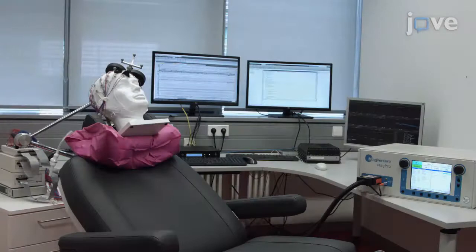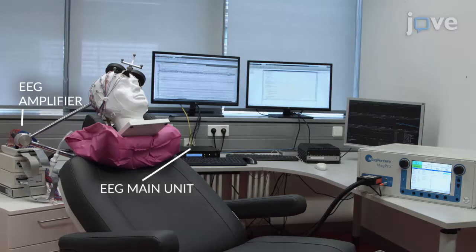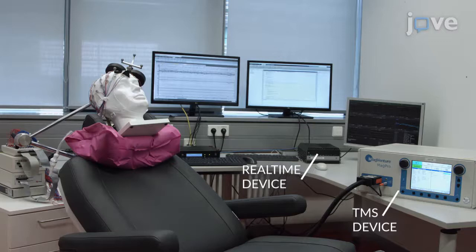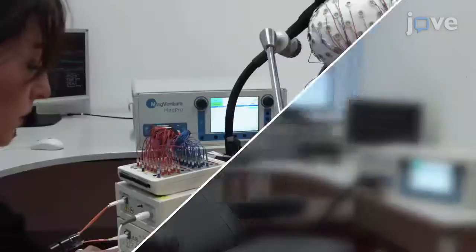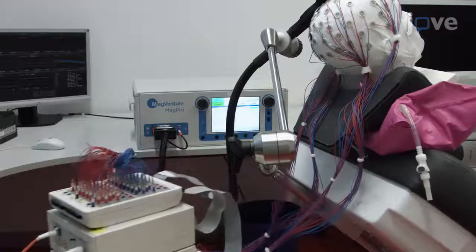To conduct a closed-loop experiment, brain activity is recorded through EEG potentials from the scalp surface that are digitized by an EEG amplifier. The signal then passes to the EEG main unit, and from there to the real-time device which controls the stimulator, thereby closing the signal loop between measuring and modulating brain activity. The real-time device analyzes the EEG oscillations and sends a trigger signal to the TMS stimulator when a predetermined trigger condition is met to pass a brief current pulse through the TMS coil that is placed on the head.